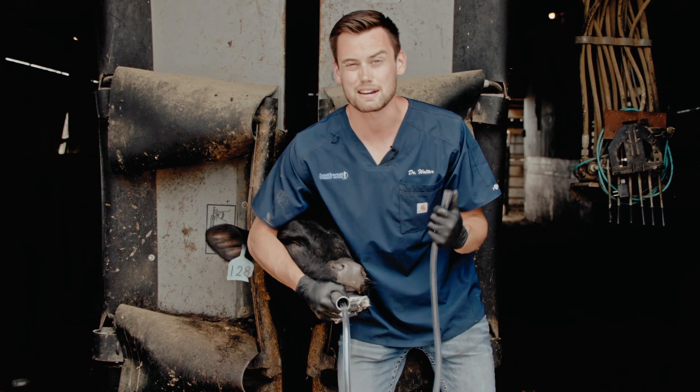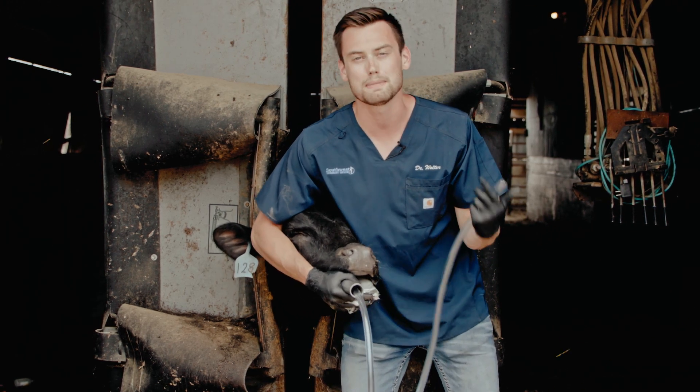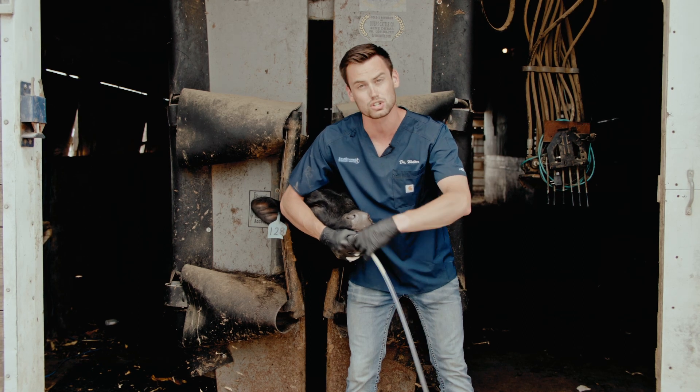It's also a good idea to add mineral oil — pour about half a gallon down the same hose for an 800-pound animal to make sure the bloat doesn't reoccur. When removing the tube, follow the exact same process in reverse and start pulling it out nice and gently.